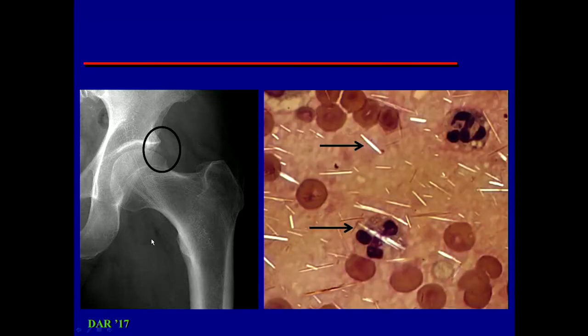And then finally, we have this patient who has a hot joint. Their hip is acutely inflamed here. They might have a little bit of chondrocalcinosis, but this sounds like a septic joint. We went ahead and aspirated it, but instead of pus, what we found was this: these calcium pyrophosphate microscopic crystals in the synovial fluid and inside the white cells, and this is a patient with pseudogout.